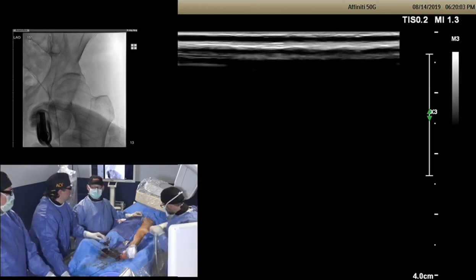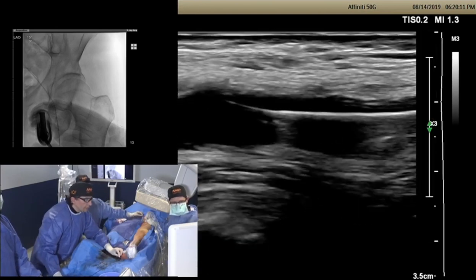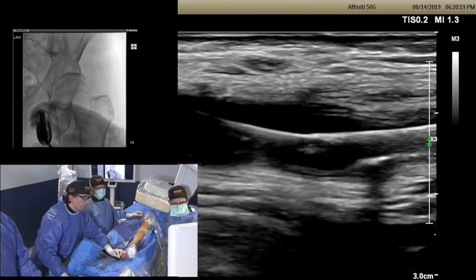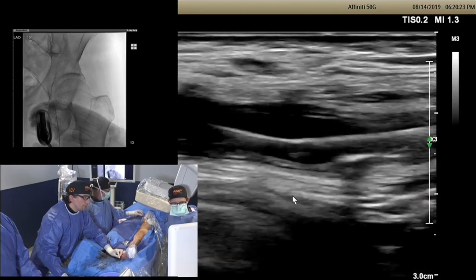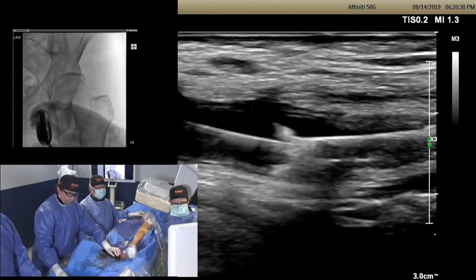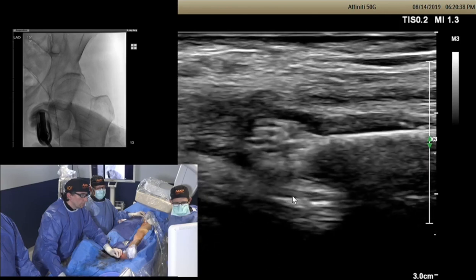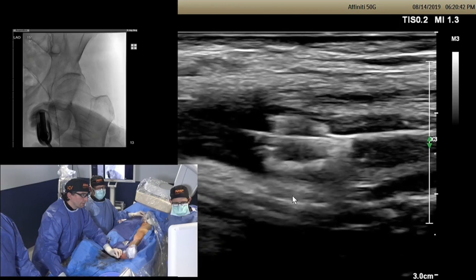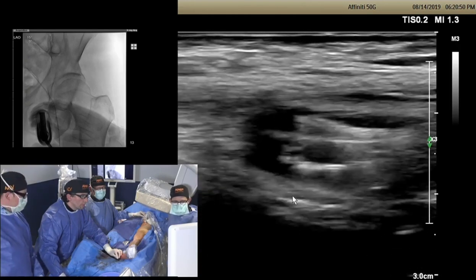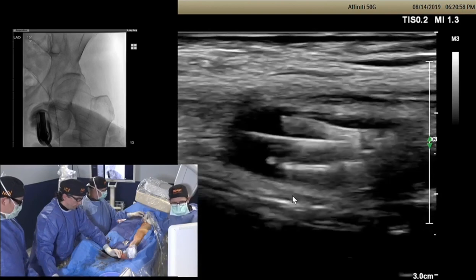I'm glad you want to stent — look at the recoiling that already has happened. Let's pull and flip it. Very good call. This is really intriguing — I'm going to flare the stent here in the common femoral. It looks very nice, keep flaring. I'm just pulling it slightly back — beautiful, that's it. That was really elegant.